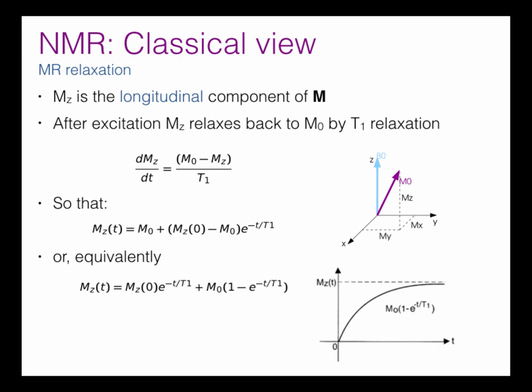Okay, so this is just summarizing how the magnetization relaxes back towards M0. It typically relaxes according to this phenomenological equation. What we see is a decay curve, basically. Whenever you start, it relaxes along a curve like this, gradually, asymptotically approaching the original M0 value.